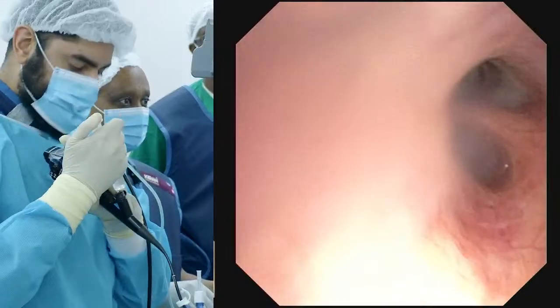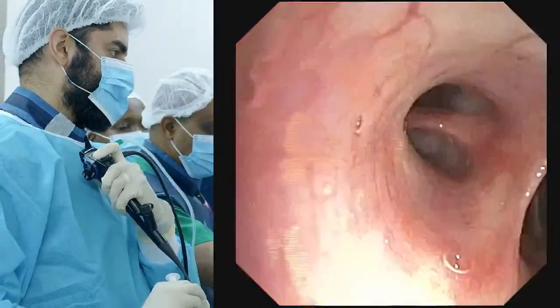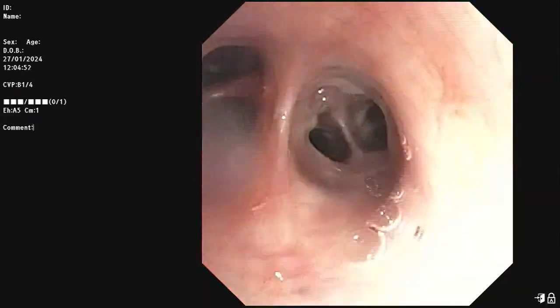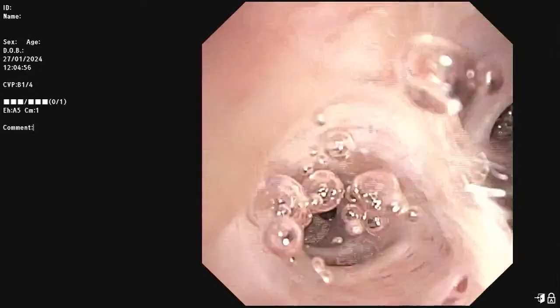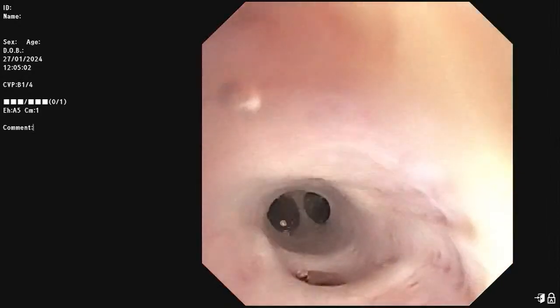It's a bit dirty, it's a little low. In fact, this is where we wanted to focus a little more on. On the right. Yes, and the basal segments. There was a lot more going on here than left.